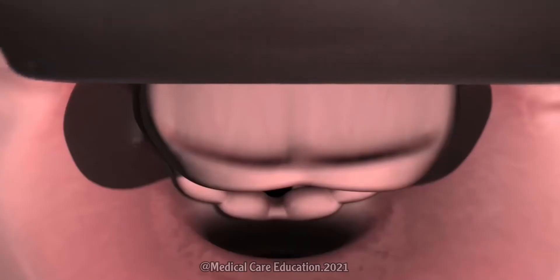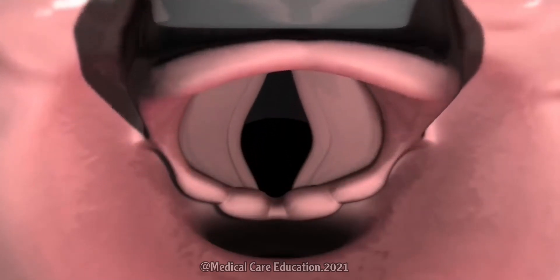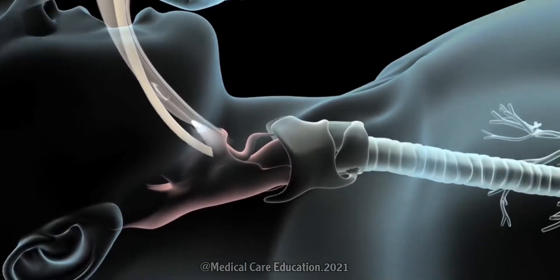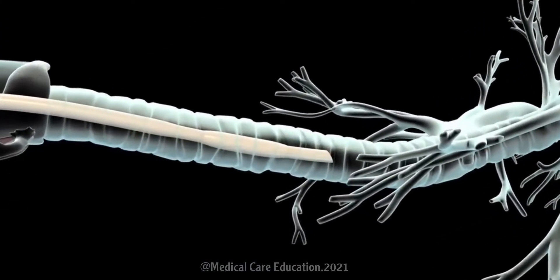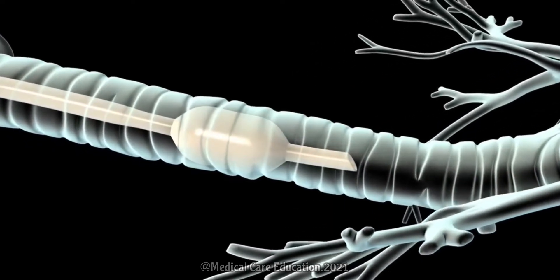Your doctor will gently raise the epiglottis, which is a flap of tissue protecting your larynx, as they advance the tip of the endotracheal tube into the trachea. Once the tube is in place, your doctor will inflate a small balloon surrounding the tube to make sure it remains snugly in place.